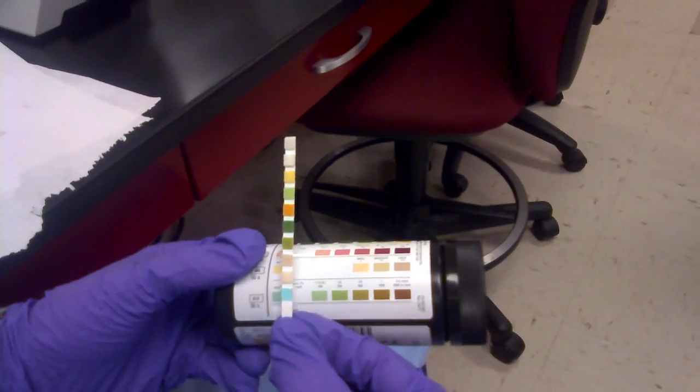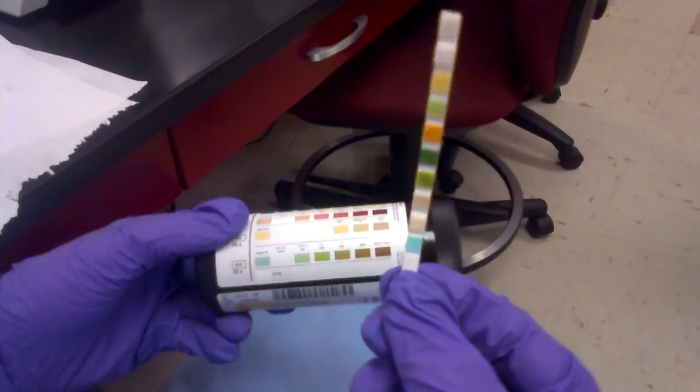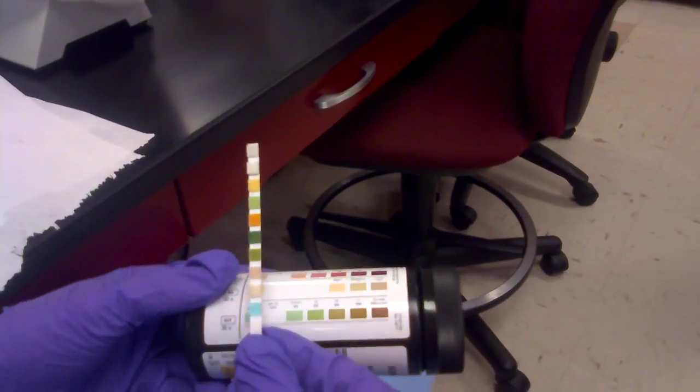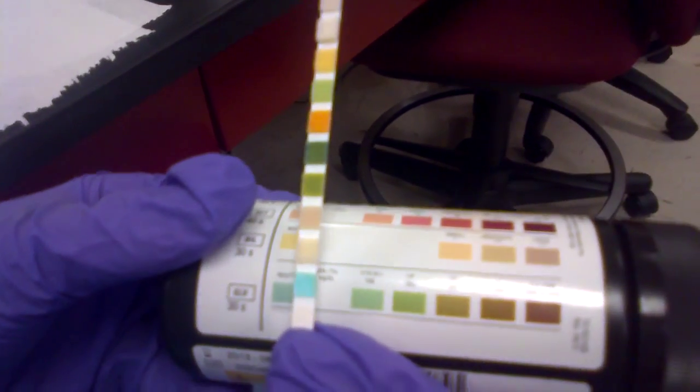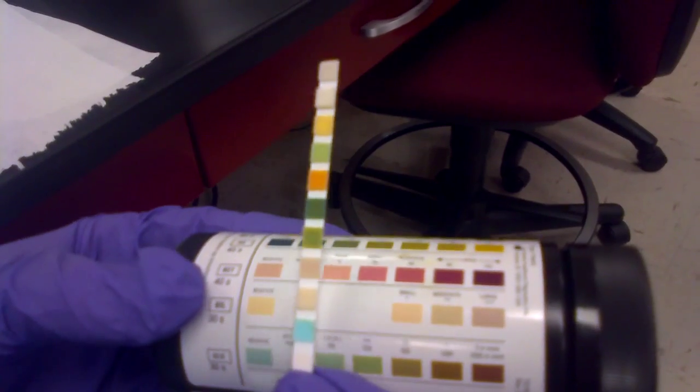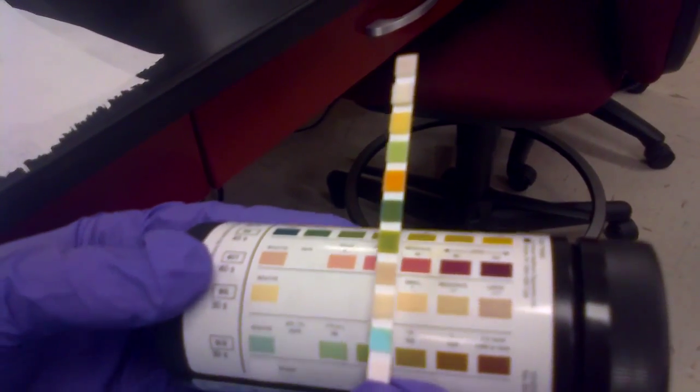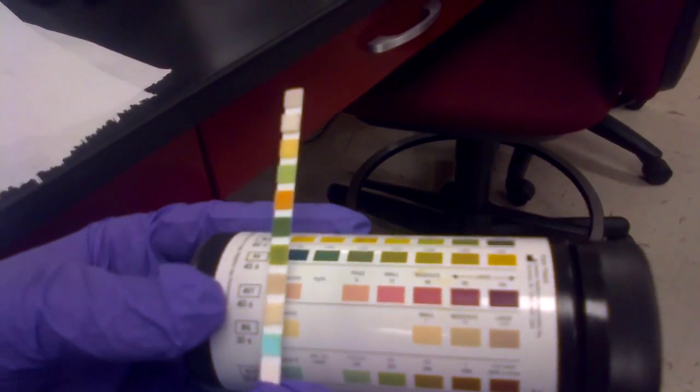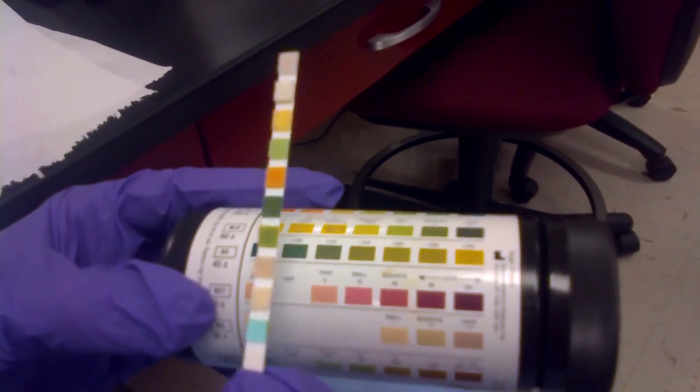To compare our results, we must match the colors from the dipstick to the actual bottle. The first test is for glucose. Here we have a negative glucose reading. Second is bilirubin. We have a small amount of bilirubin. Next is ketones. We have a negative color for ketones.